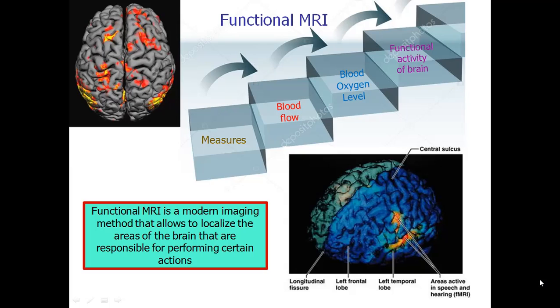The information from functional MRI images also helps a doctor to determine the most effective treatment or assess how well a chosen treatment is working.